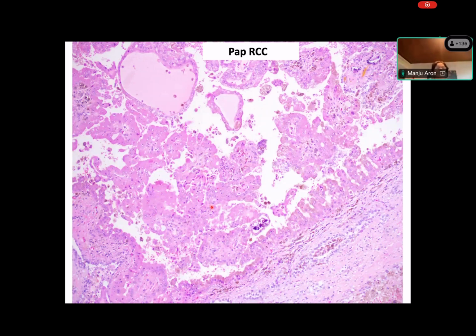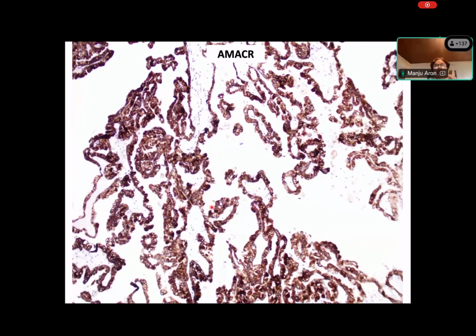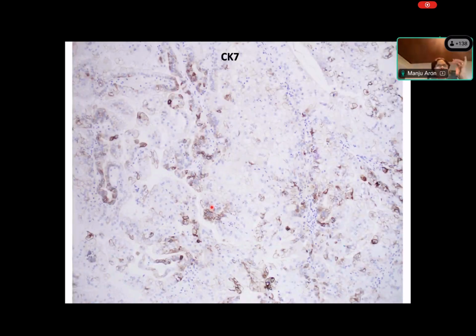These are all called type 2 papillary RCCs, but currently we don't divide papillary renal cell carcinomas into type 1 and type 2. They're all just under one uniform morphological term of papillary renal cell carcinoma. One stain that is really good in the differential diagnosis of this tumor is racemase, which is positive in papillary renal cell carcinoma. CK7 is diffusely positive in the so-called type 1 papillary RCCs, but may be very focal or patchy in the so-called type 2 papillary RCCs. So that can vary a lot.